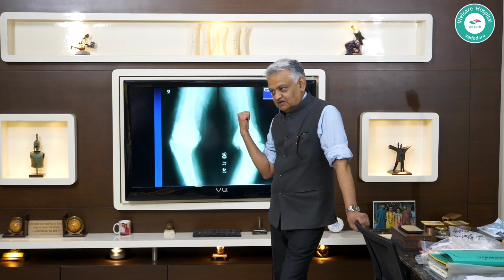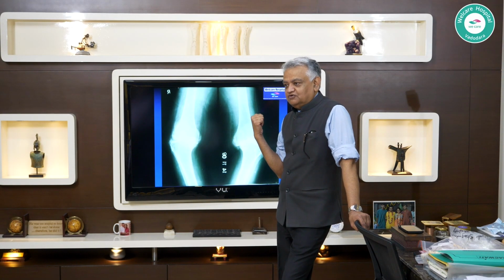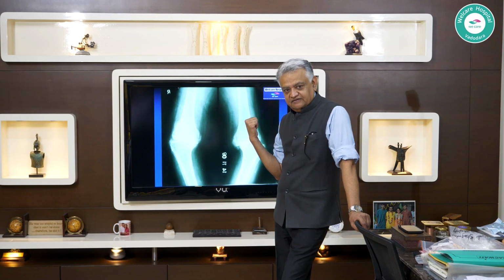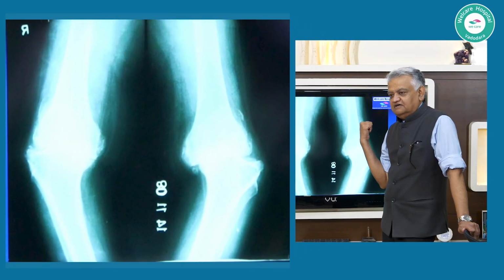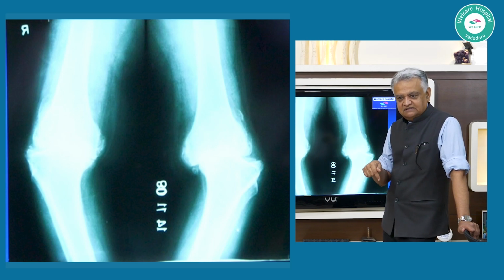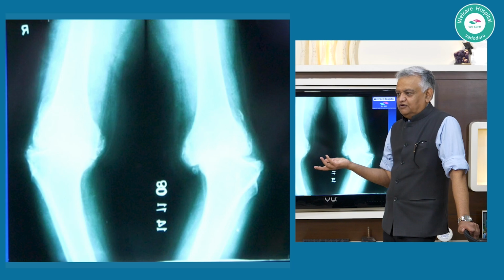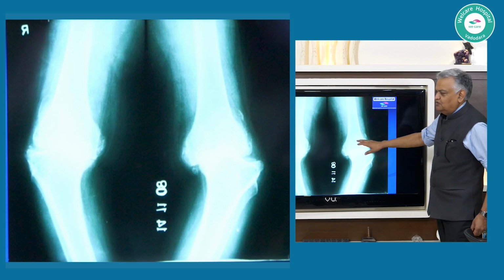If your eye has not picked up on this, because your brain was not aware of the implication, then it is on the table that you will find that you have neither an extender rod, nor have you mentally thought about putting those wires, and you don't have an augment on hand. So be prepared.